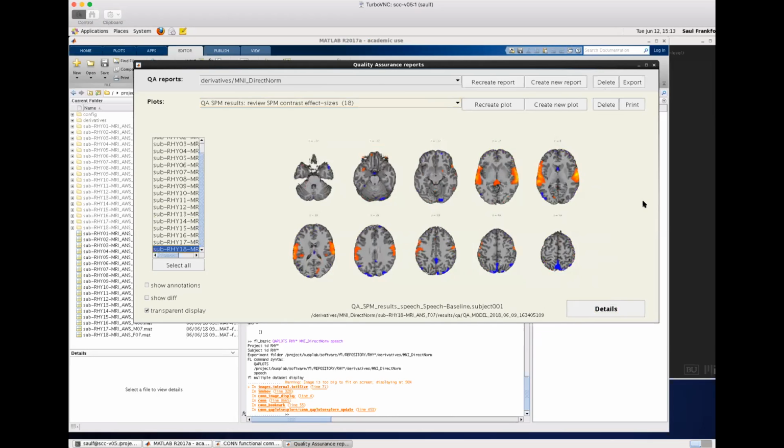Is there an advantage doing one versus the other? Yes, it helps if you remove them in the way that Art is removing. Basically, remove every individual scan, then you are helping. You're removing those scans entirely, even from the residual error of the first level model. If you just remove the average, then there is still going to be some variation happening within the scans that ends up being part of the residual error.